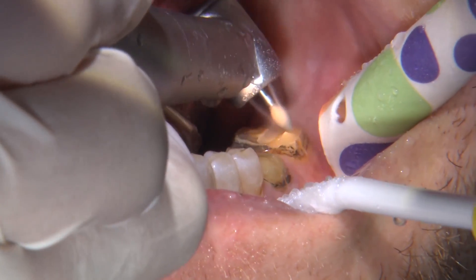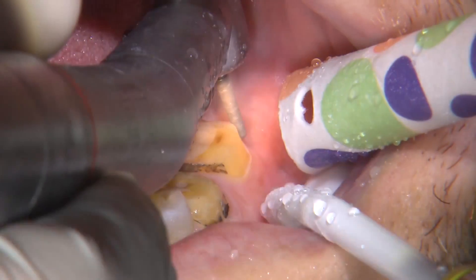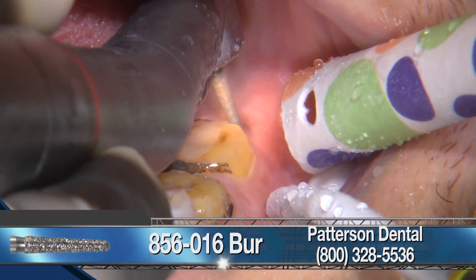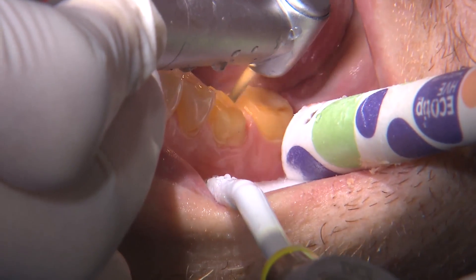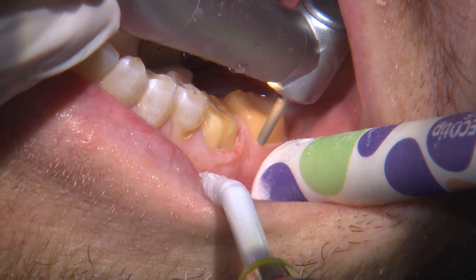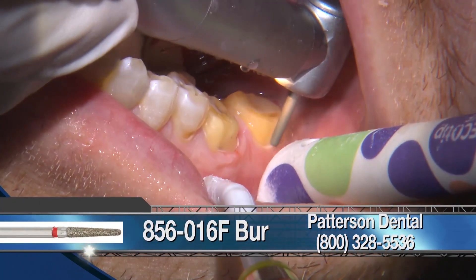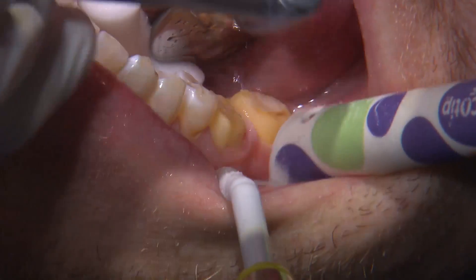Even though PFMs were placed previously, there was still a lack of reduction. I do most of my gross reduction with a coarse, round-ended tapered diamond. Once I have most of the reduction occlusally and axially — about one millimeter of reduction — and once the overall gross reduction is completed, I will refine the preparation with a fine, rounded tapered diamond.